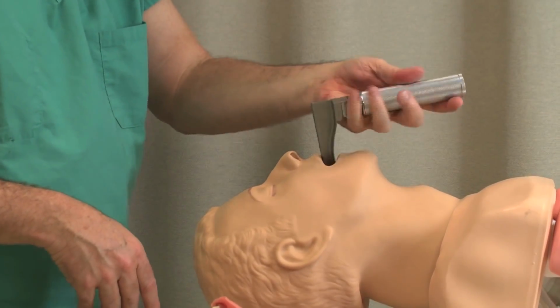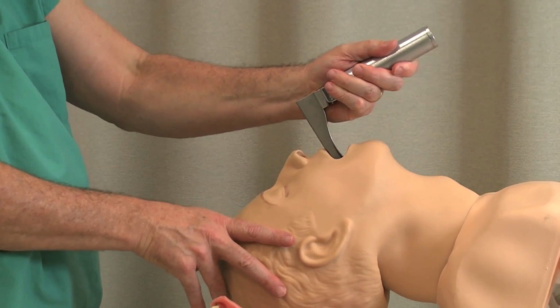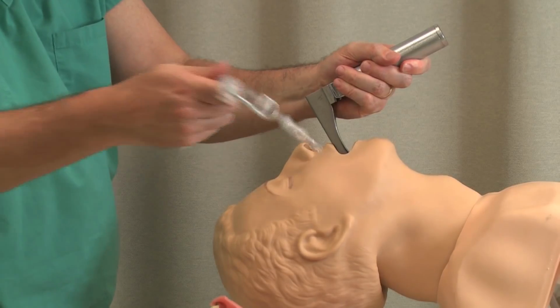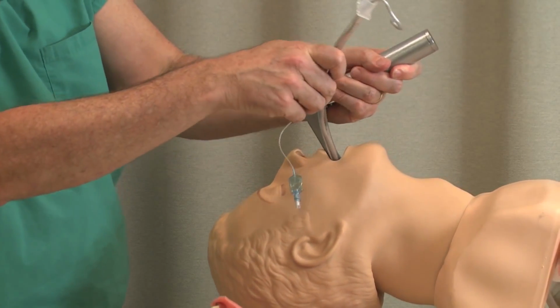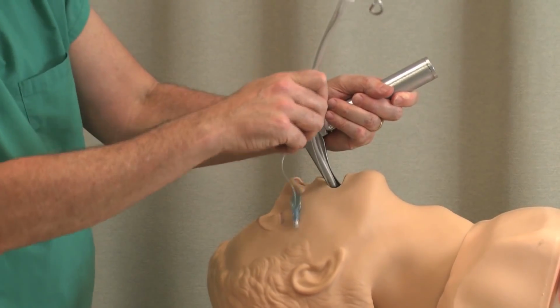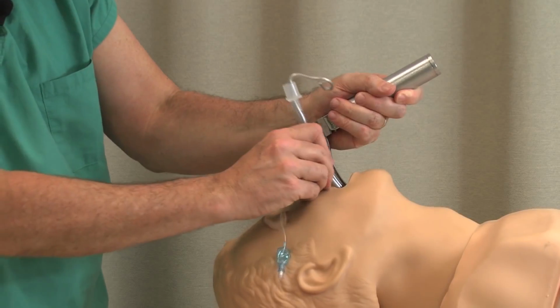So once you get the view, and again you lift, you might have to come back a little, the epiglottis pops down, and then you lift again. Now, I usually try to come in from the side a little bit so that I don't obscure my view. Slide it through the cords.